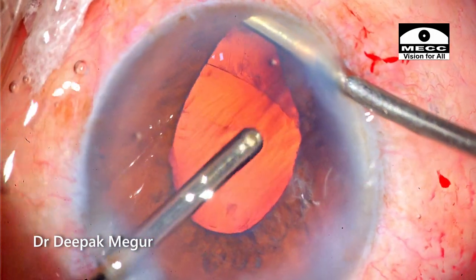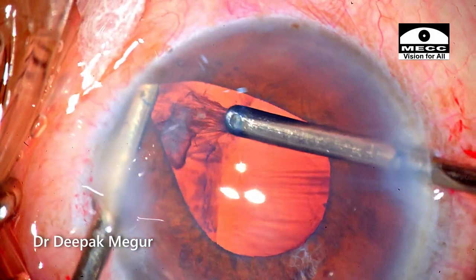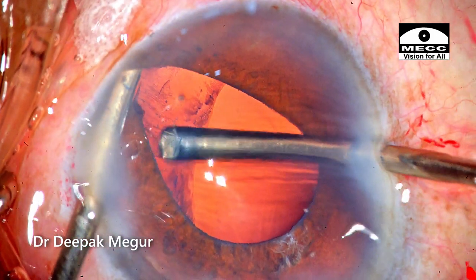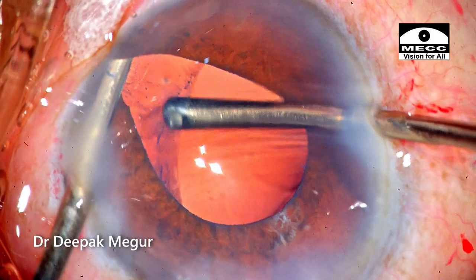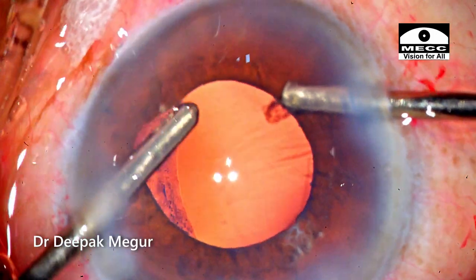So this quadrant seems to be done. Now let me go back to the area of suspected localized zonular dehiscence. I'm retracting the iris with my irrigation handpiece so that I see well. And carefully and slowly I'm able to strip the cortex in this weak area. The bag is clean now.